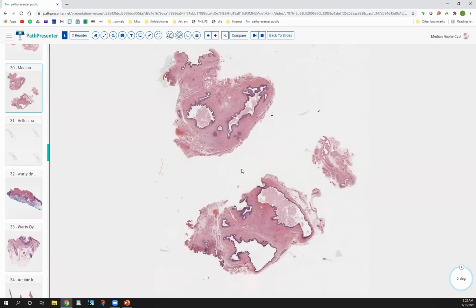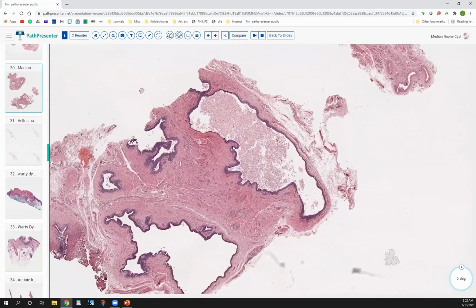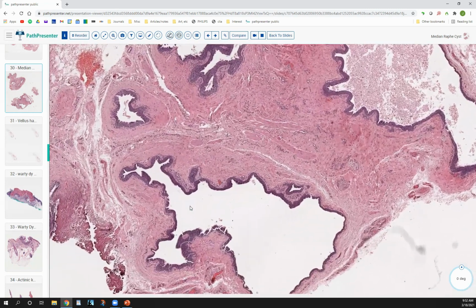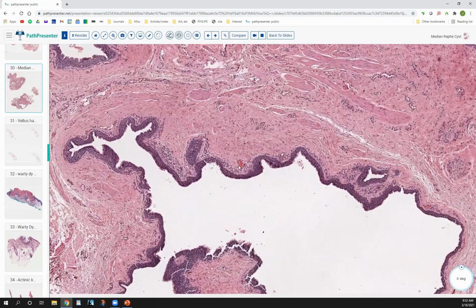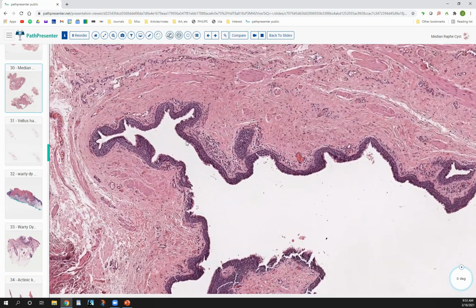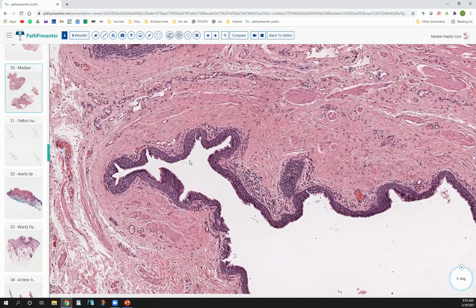All right, and yet another cyst that's unusual. This one, again, content-wise, having this sort of non-specific kind of frothy material. And this is another one where the epithelium may not look entirely familiar to you. I don't see it too much in daily practice, actually. And it's got a name that I think is quite adequate for this. It's not quite mucinous epithelium like what we've been looking at, and it's not quite a skin epithelium. It's somewhere in between. So it's like a transitional type epithelium.